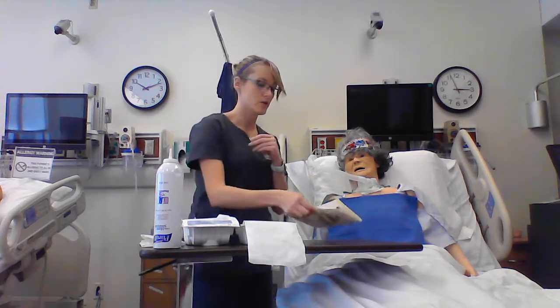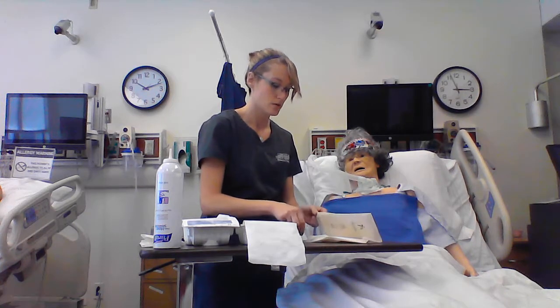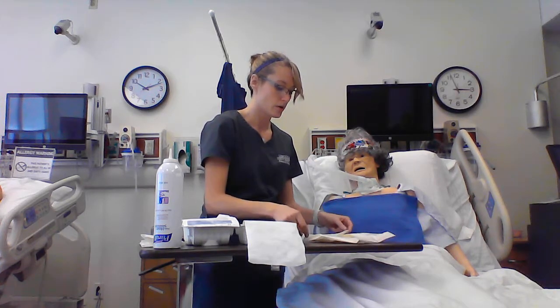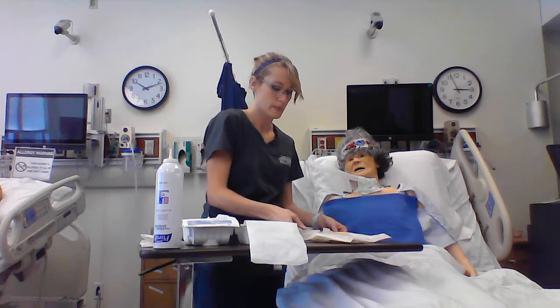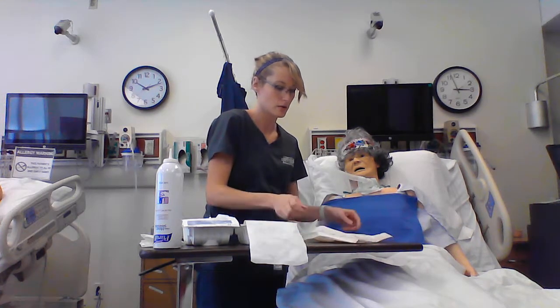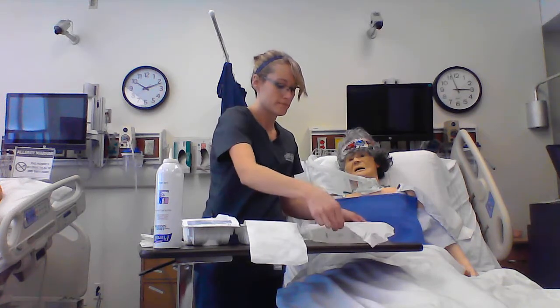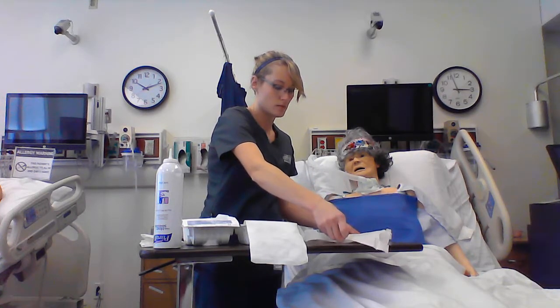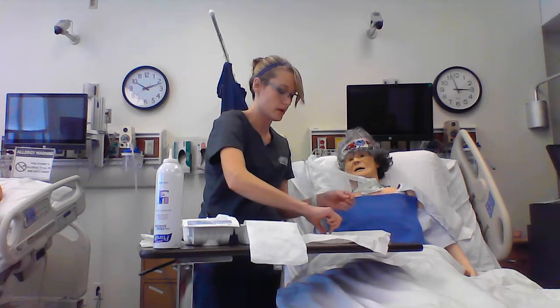So I would take my sterile gloves and open them, opening the outside package away from me, pulling these out. Mind your 1-inch border and open your gloves up. I did bump the outside of my container there, but I did not contaminate anything in the sterile field. And my hands were not sterile at the time, so it should be fine.